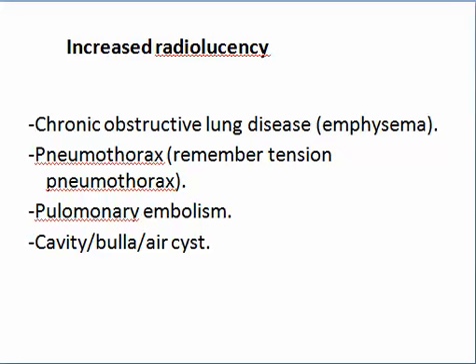Increased radiolucency is the reverse, due to the presence of a cavity, a cyst, or bulla, or emphysema, or pneumothorax, or decreased volume of blood, as in pulmonary embolism.